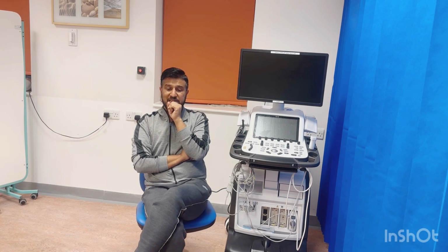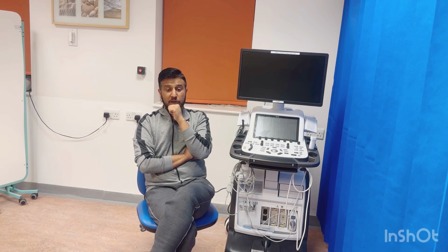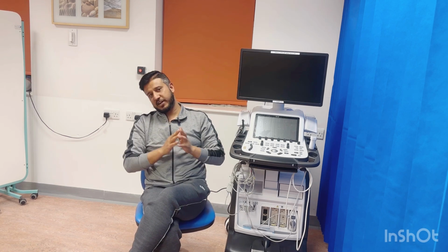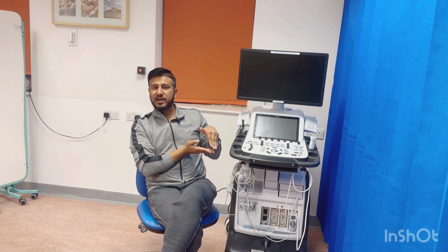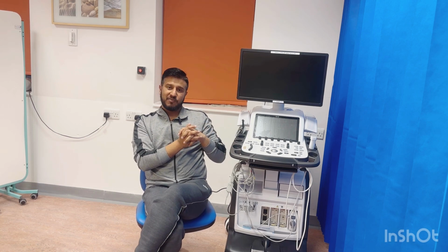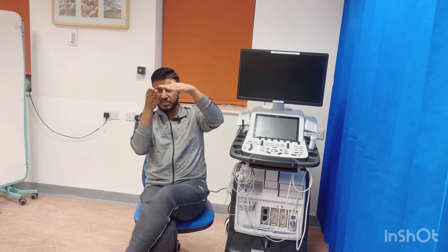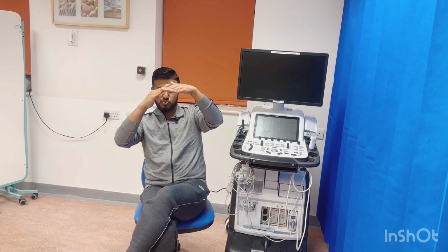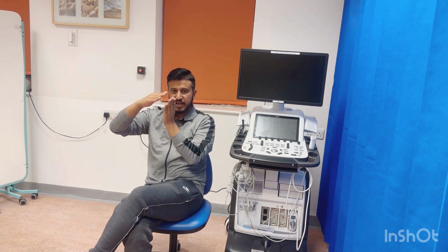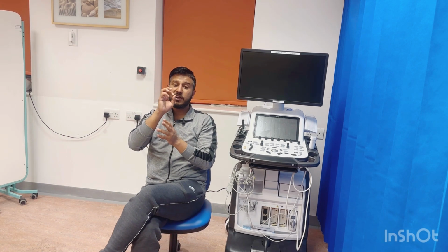Another thing which most of us usually miss in these cases is that, as I said, most of the time aortic jets are not very central. They are either going to one side, towards the septum, or towards the mitral valve. So in parasternal long axis, the jet would be coming this way or going this way. If you have this sort of jet in parasternal long axis, you can just move your image to align the cursor, and you can get a very good Doppler.